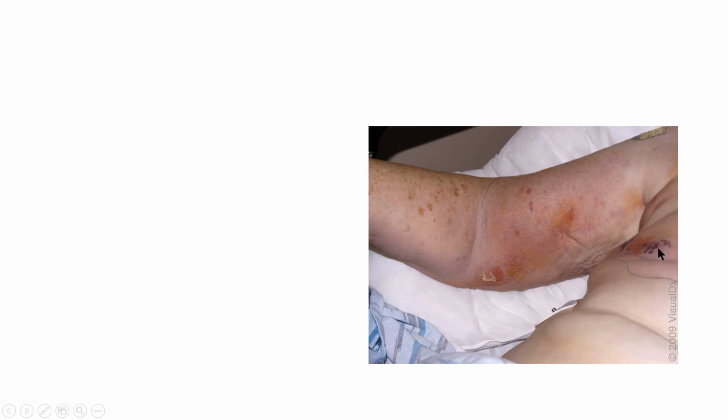If we pressed on them and they didn't go away, we would say they are petechial. And so we're asking ourselves, well, could this be cellulitis? Well, the answer to that question is it is not. It is, in fact, necrotizing fasciitis.